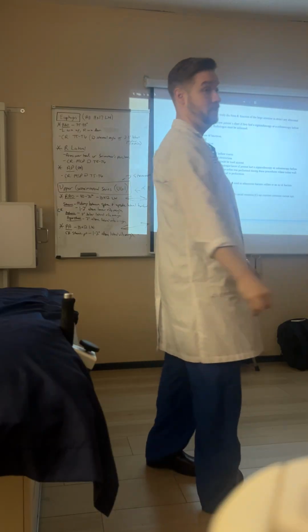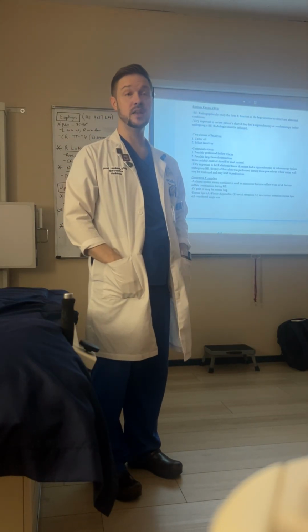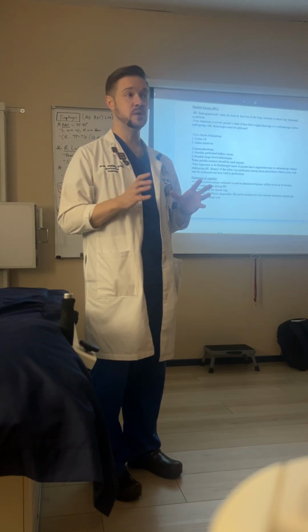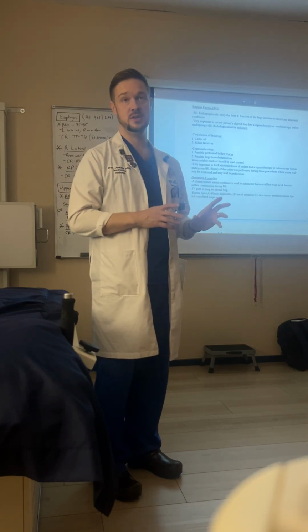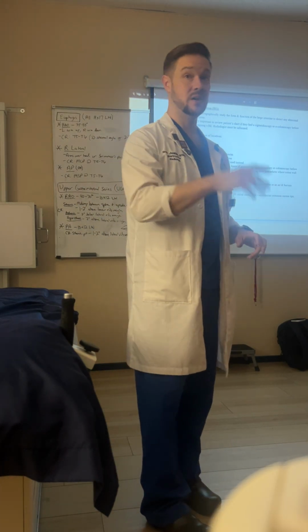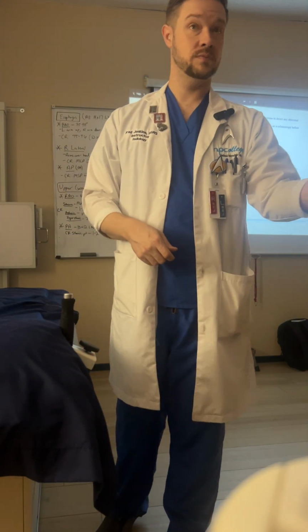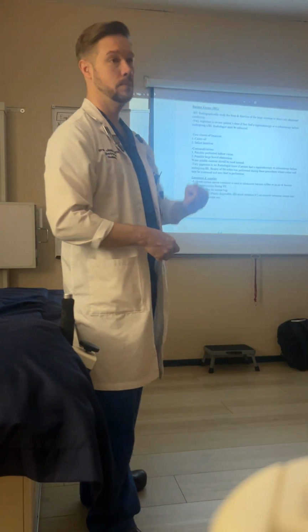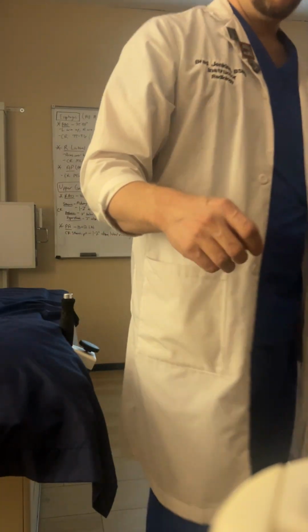It's very uncomfortable. So the radiologist is the one doing this procedure as well? Yeah. The radiologist is mainly responsible for a lot of the manipulations for a BE because of the risk of perforation. So they're going to control how much barium goes in, either by doing it themselves or by letting you know, turn it on, turn it off, and they're going to control the amount of air that they put in. Anything with fluoro, the doctor has to be present.